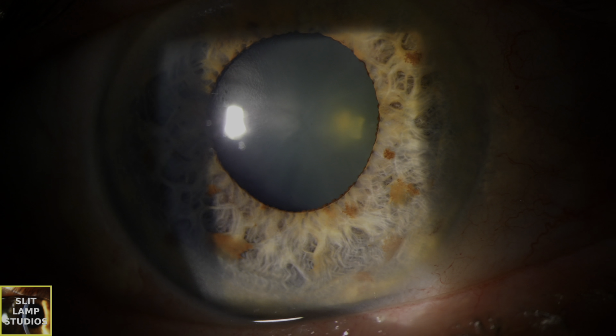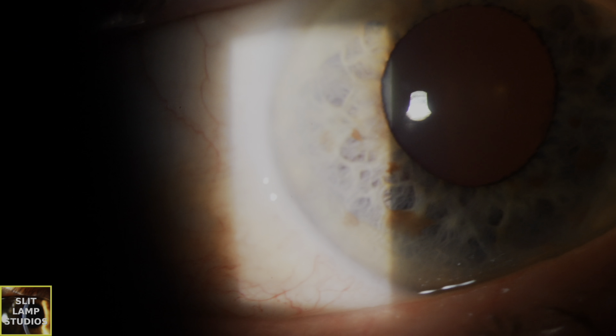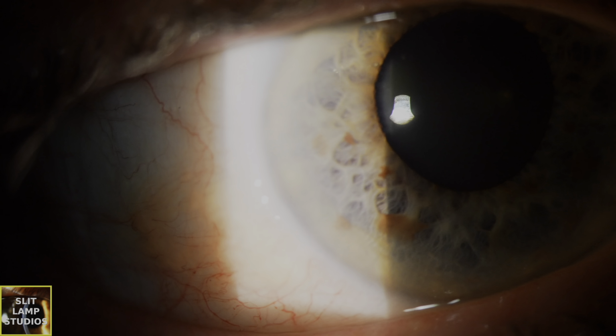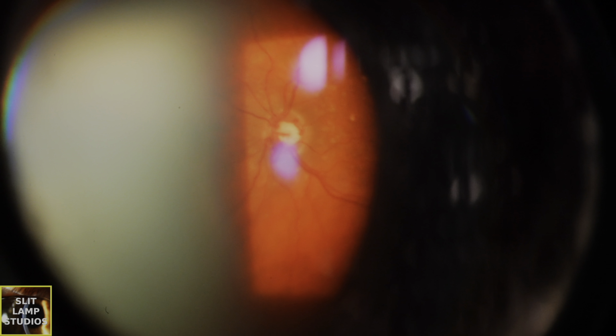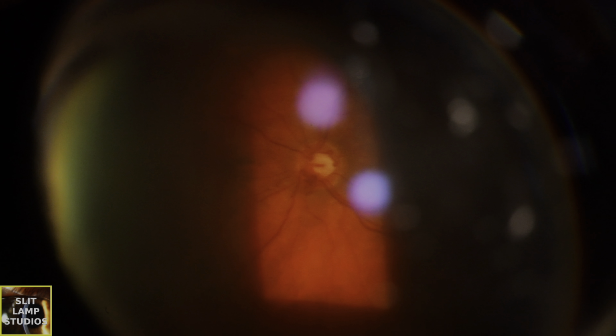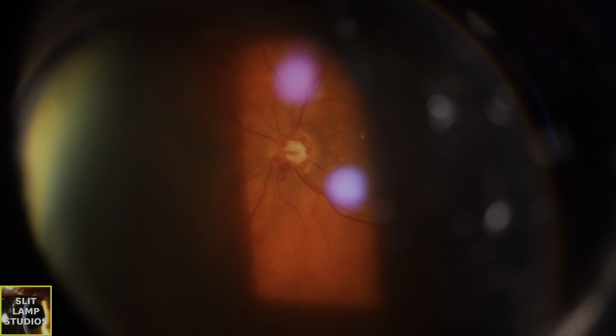Disc collaterals may typically appear weeks to months after the initial occlusion, once the eye has had time to remodel its microvasculature. We see these here as tortuous, engorged vessels on the optic disc without any accompanying hemorrhage or exudation, which is exactly what we're seeing right now. They're best appreciated on fluorescein angiography, but we can also see them on slit lamp examination. Their presence indicates a chronic or resolved CRVO rather than the acute event, and they do not signify neovascularization. You need to make that distinction.